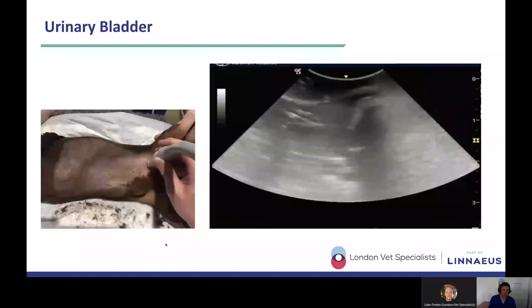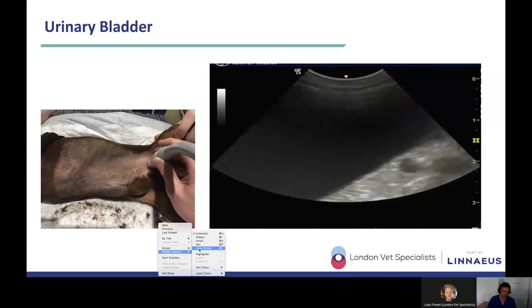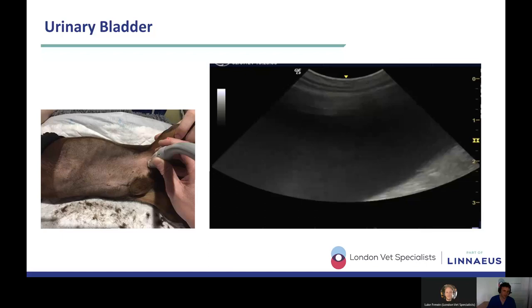So those are the medial iliac lymph nodes. And from there, it's just a short walk to the urinary bladder. So just sliding ventrally, essentially. So now, in order to get nice images of the urinary bladder, you are going to have to just lift up the patient's hind limb.